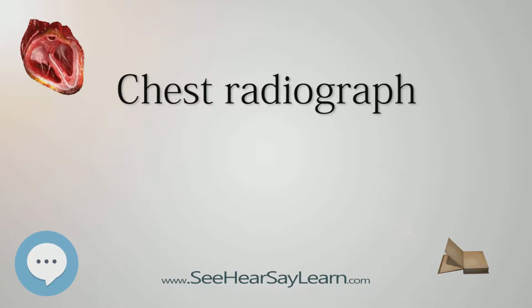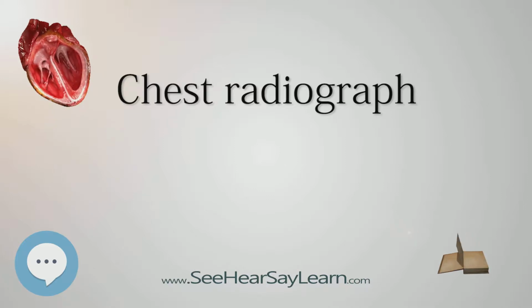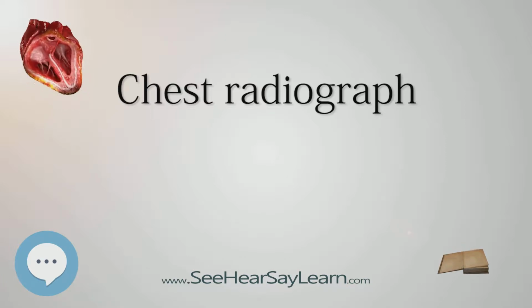AP chest X-rays are harder to read than PA X-rays and are therefore generally reserved for situations where it is difficult for the patient to get an ordinary chest X-ray, such as when the patient is bedridden. In this situation, mobile X-ray equipment is used to obtain a lying-down chest X-ray, known as a supine film. As a result, most supine films are also AP.